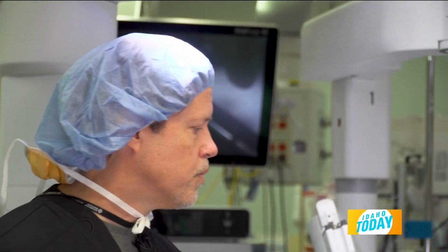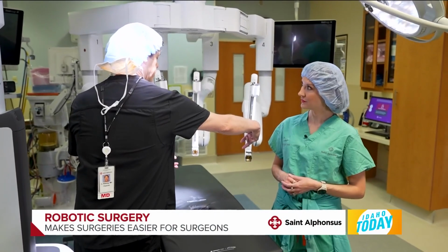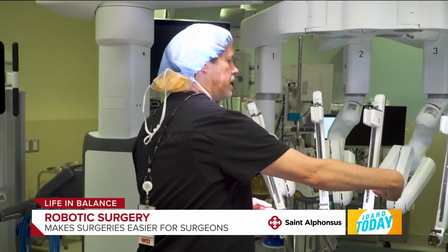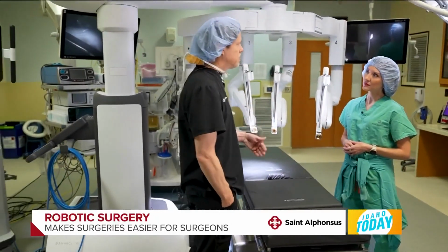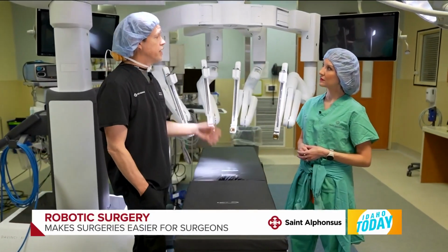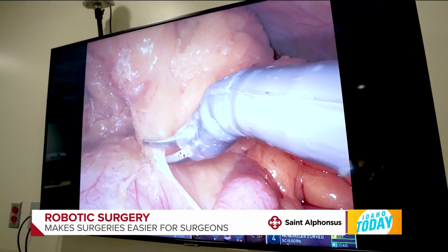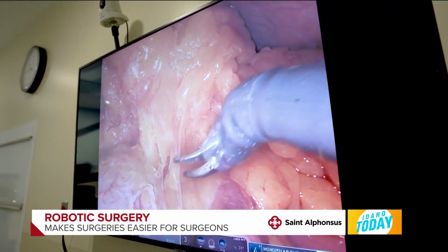Okay, and what is the benefit for you as a surgeon taking advantage of this type of technology? It's huge. When I was doing all my surgeries laparoscopically, I would stand at the bedside and lean over like this over the patient to hold instruments. So all my weight is on my right ankle, right hip, right back, and my arms and wrists are tilted in unnatural ways, and over case after case, year after year, you get arthritis. So it decreases the length of life of a surgeon. So moving over to a console where you can sit with good posture, look in a viewfinder, and control 4 arms instead of just having 2 leads to an extended life with less arthritis.